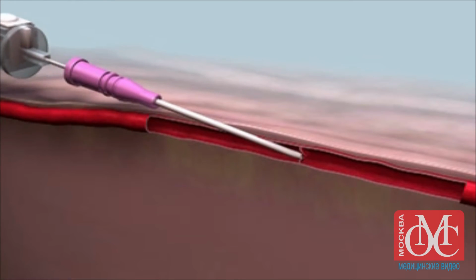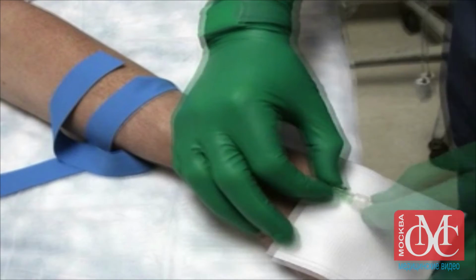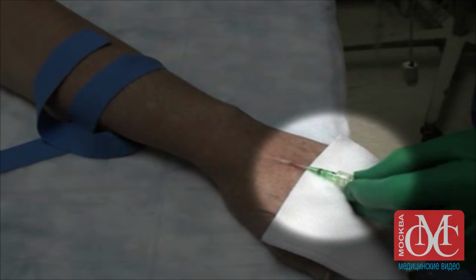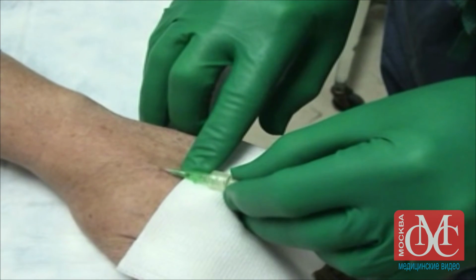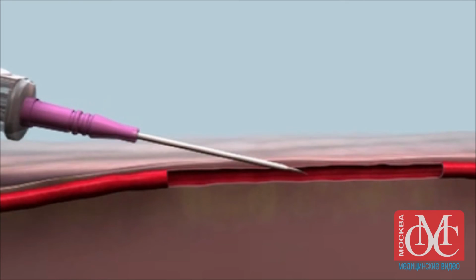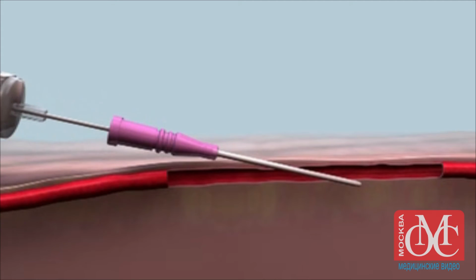If this occurs, hold the cannula hub in place, remove the tourniquet, and connect the intravenous tubing to the cannula. Running fluid into the vein may open the valve and allow the cannula to be completely inserted. Occasionally, it is possible to advance the catheter when it is outside the vein or when the catheter has perforated the vein's opposite wall.